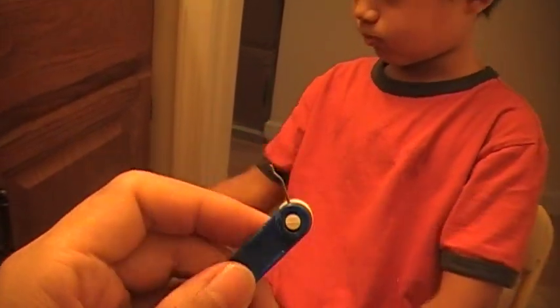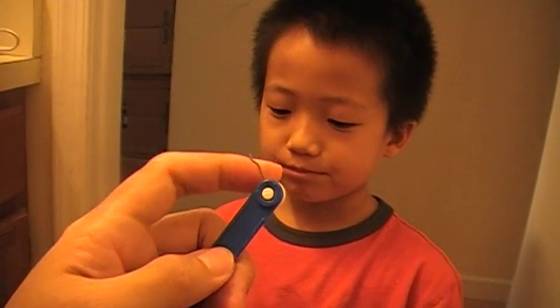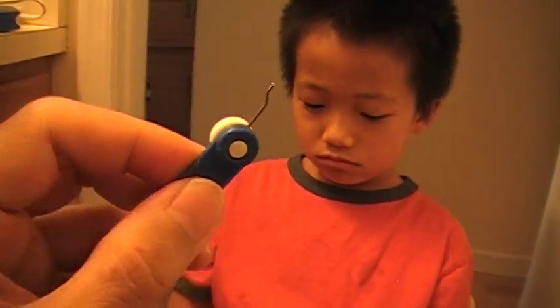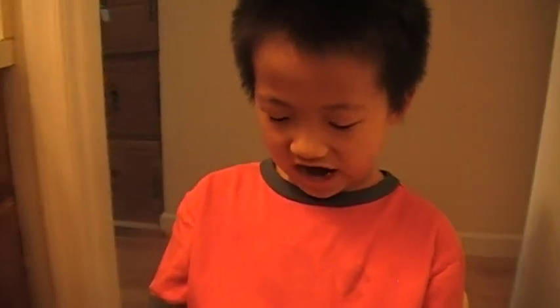After that, it is time to do the turning. This is the turning key — it has a little metal part to it. You put this in the mouth, in the middle.